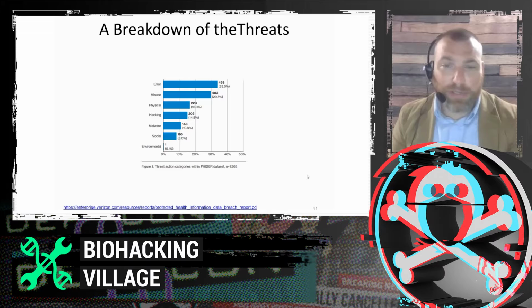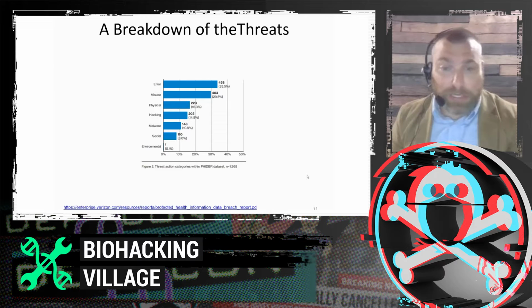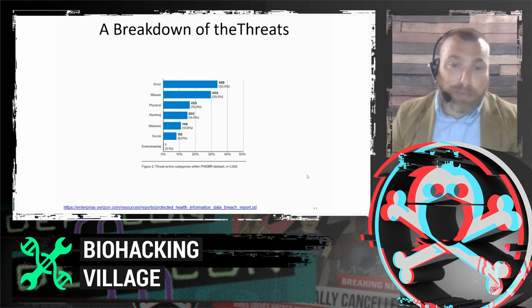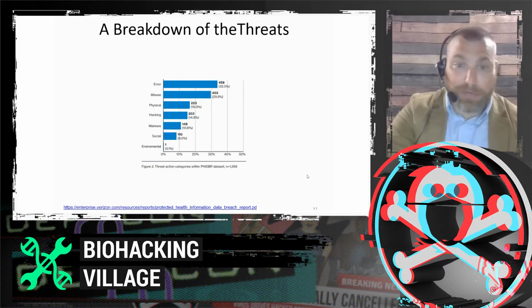And what's interesting with this graph, I think, is if you look on the news or just search cybersecurity in healthcare, pretty much what you're going to see is a lot about ransomware, and certainly we'll talk about ransomware in this presentation, about how prevalent it is and how it's becoming much more prevalent. But it's just important, if you're trying to defend the hospital's network, to know where your threats are really coming from. Certainly we want to defend against quote unquote hacking or malware, ransomware, but we also want to make sure that we're aware of the fact that our largest threat landscape, or our largest threats, might actually be already inside the building, someone that we've actually given access to.